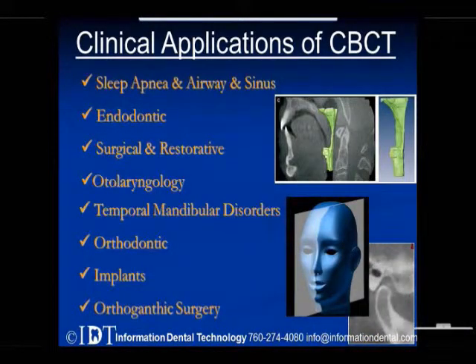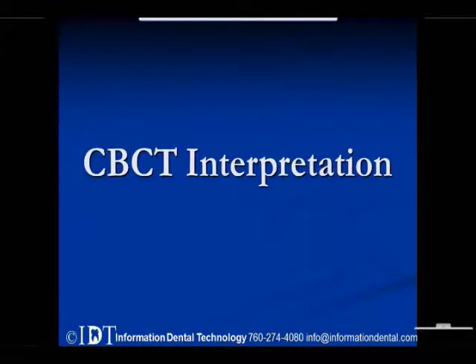And here's a list of all the different types of clinical applications for cone beam. You'll notice there's endodontic application, temporomandibular disorders, orthognathic surgery. Tonight we're going to focus on implants, but just so you have an idea of how this can relate to different referring doctors that you work with.